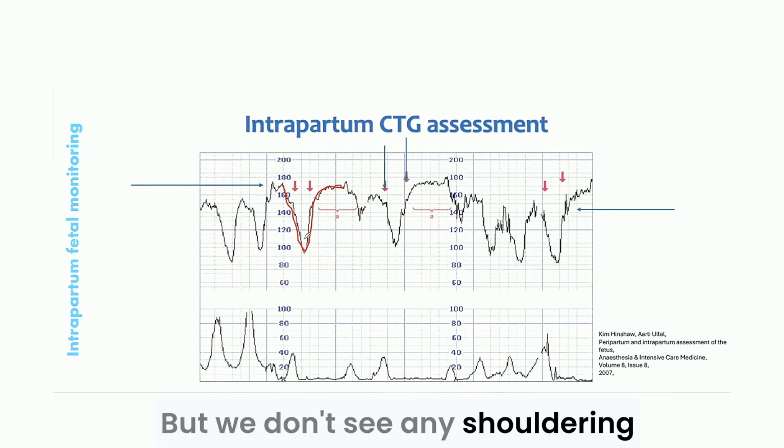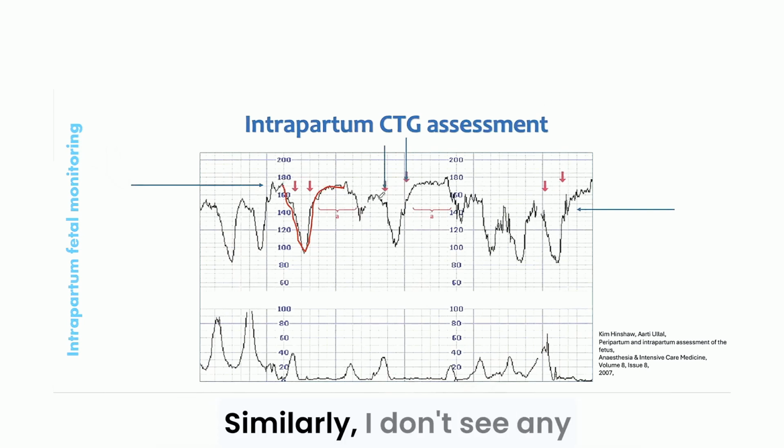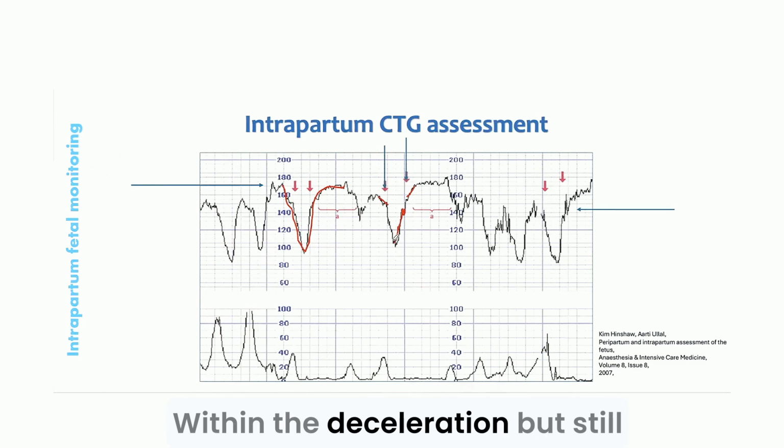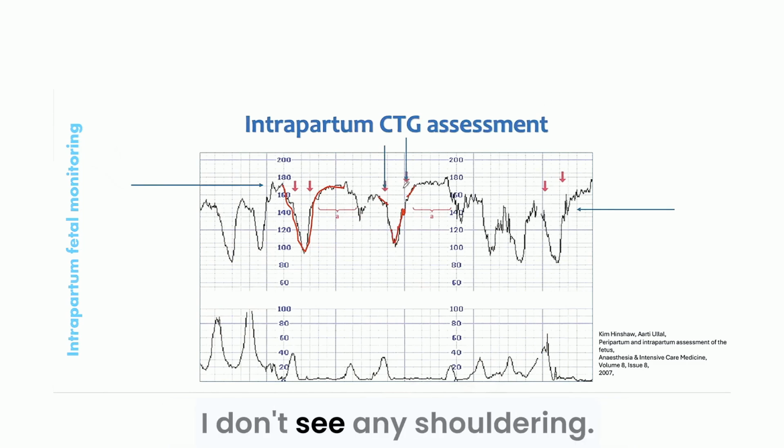But we don't see any shouldering with these decelerations. Similarly, I don't see any shouldering here, and I don't see any shouldering here as well. I can see some probably good variability within the deceleration, but still, I don't see any shouldering.